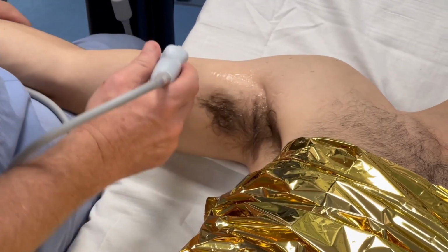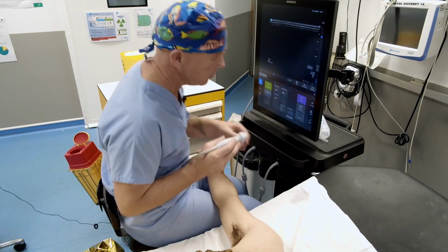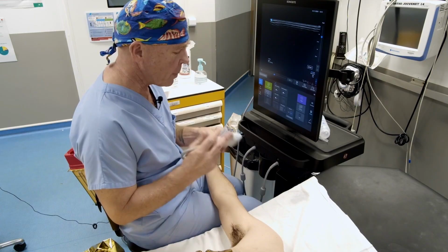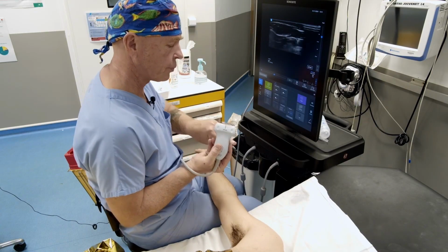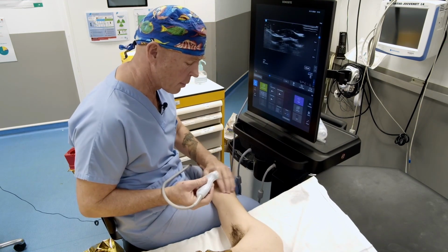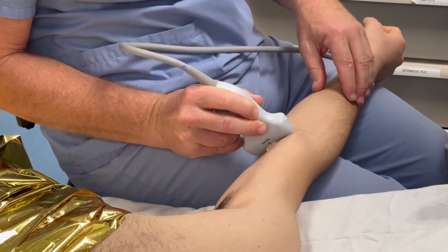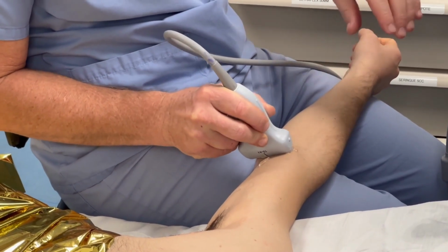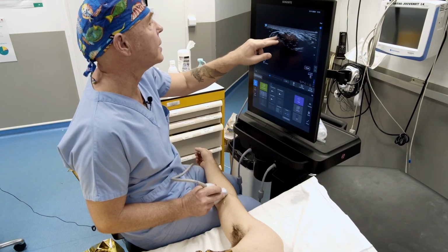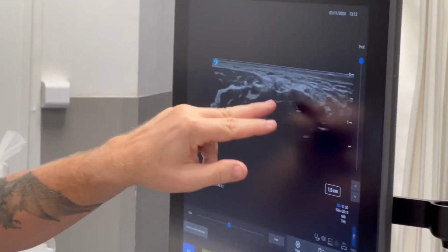We're going to take advantage of this position with the additions at the elbow. Now, this is very important and very interesting. I'm going to take my gel, simply because you keep the same position. You take the line of the elbow and you place your probe. So here, as you can see, it's the same as before. You need to reduce a little to focus and optimize your image. We can see the artery here with the median nerve. It's a bit like the image we had earlier. You see the artery and the median nerve.